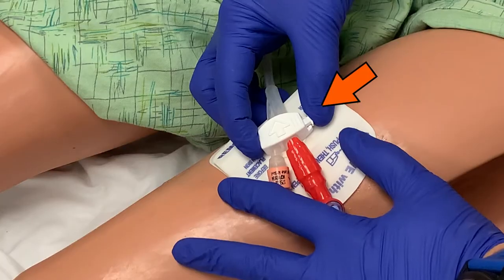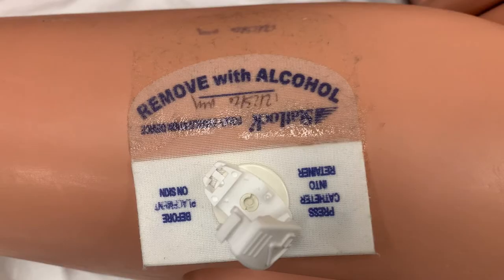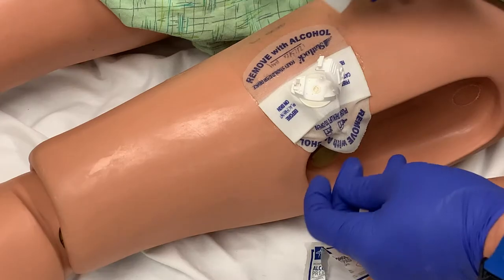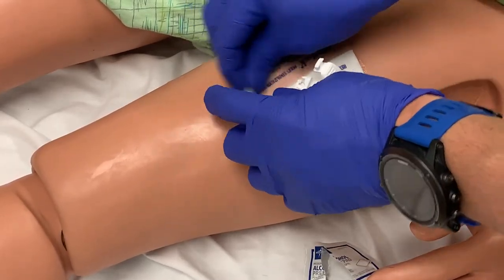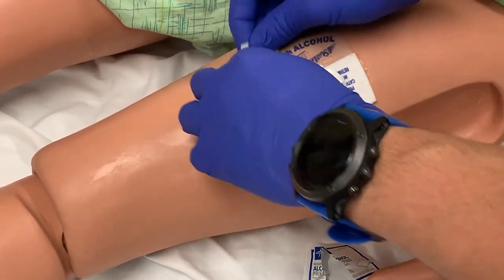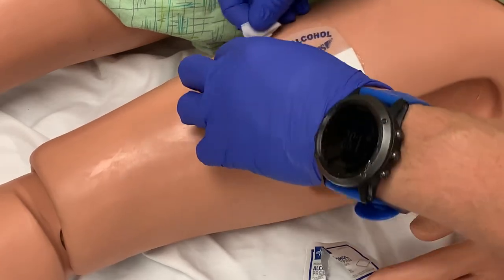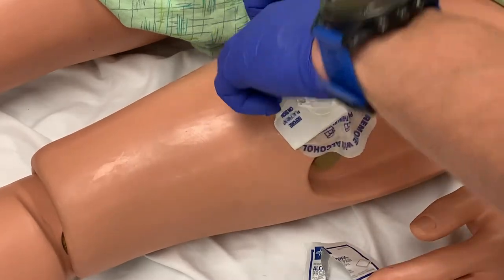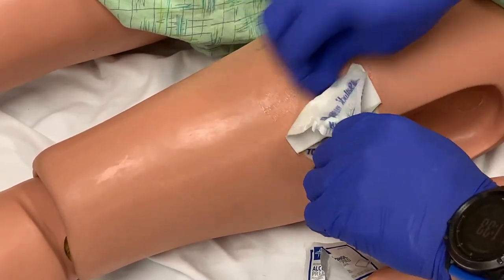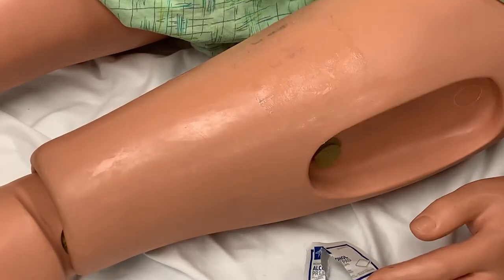Now move to the stat lock. Free the catheter from the stat lock by pinching the clasp and lifting up. Remove the stat lock from the patient's leg using alcohol prep pads — rub the pad around the edges of the stat lock. The alcohol will help neutralize the adhesive, allowing you to easily peel up a side and continue rubbing where it is still attached to the skin. This method is significantly less painful for the patient and eliminates the risk of skin damage that could occur if the device were quickly ripped off like a band-aid.